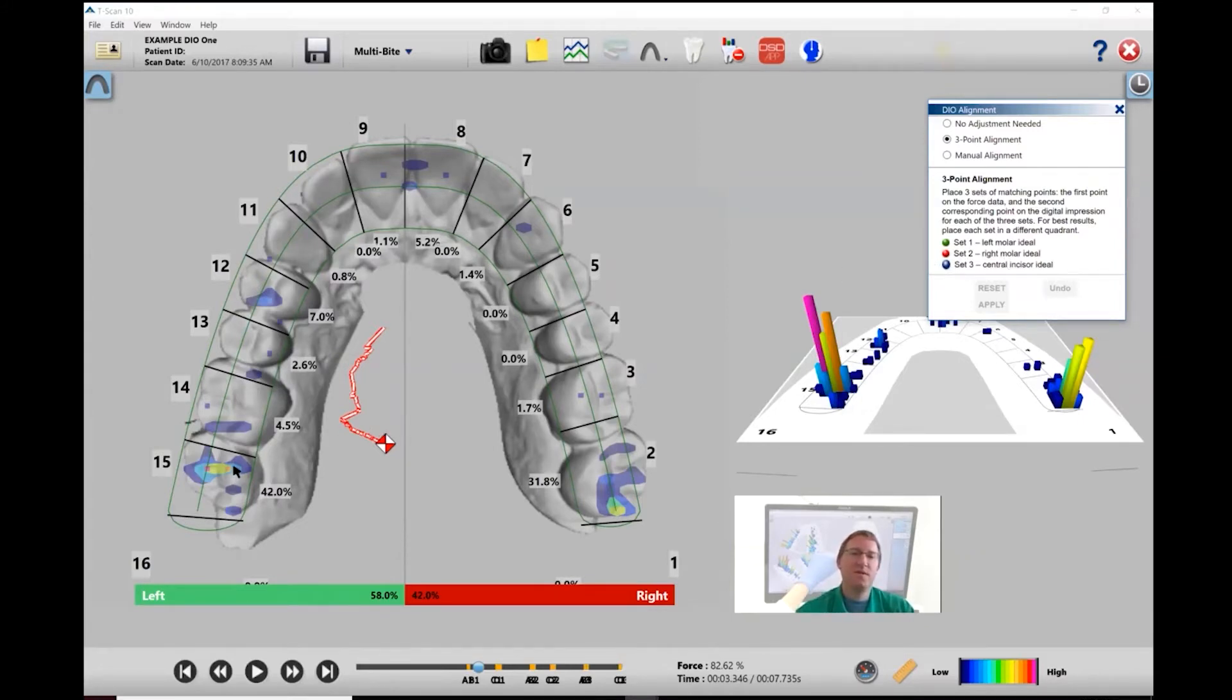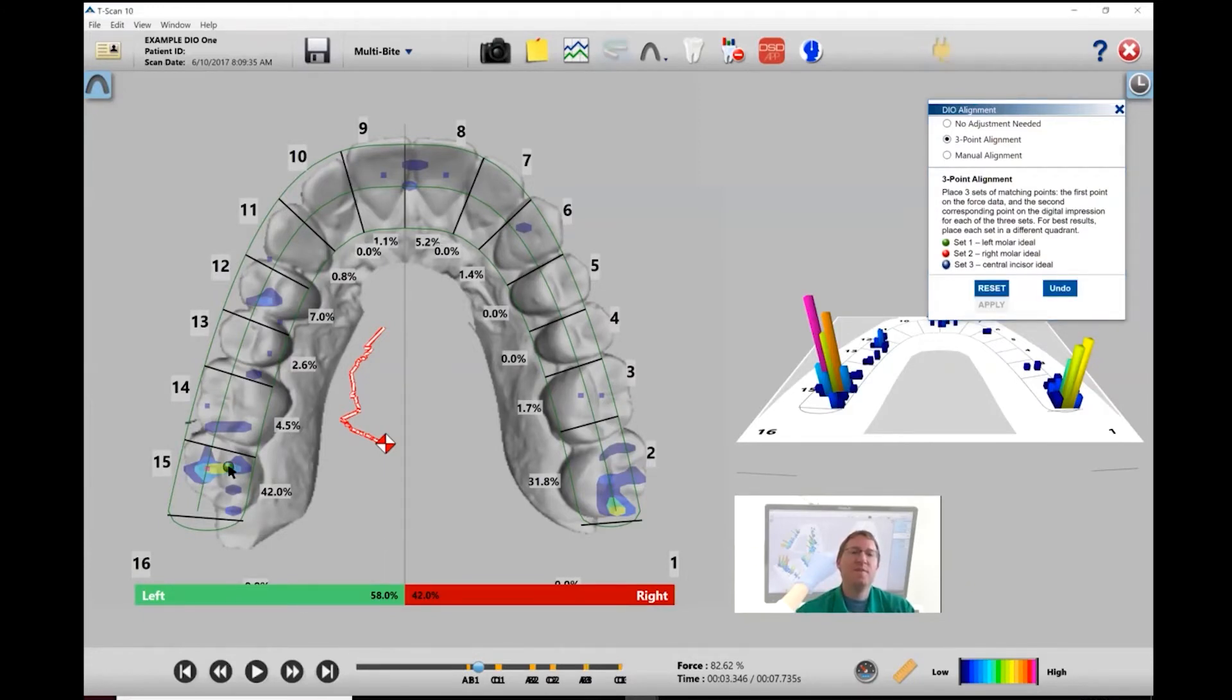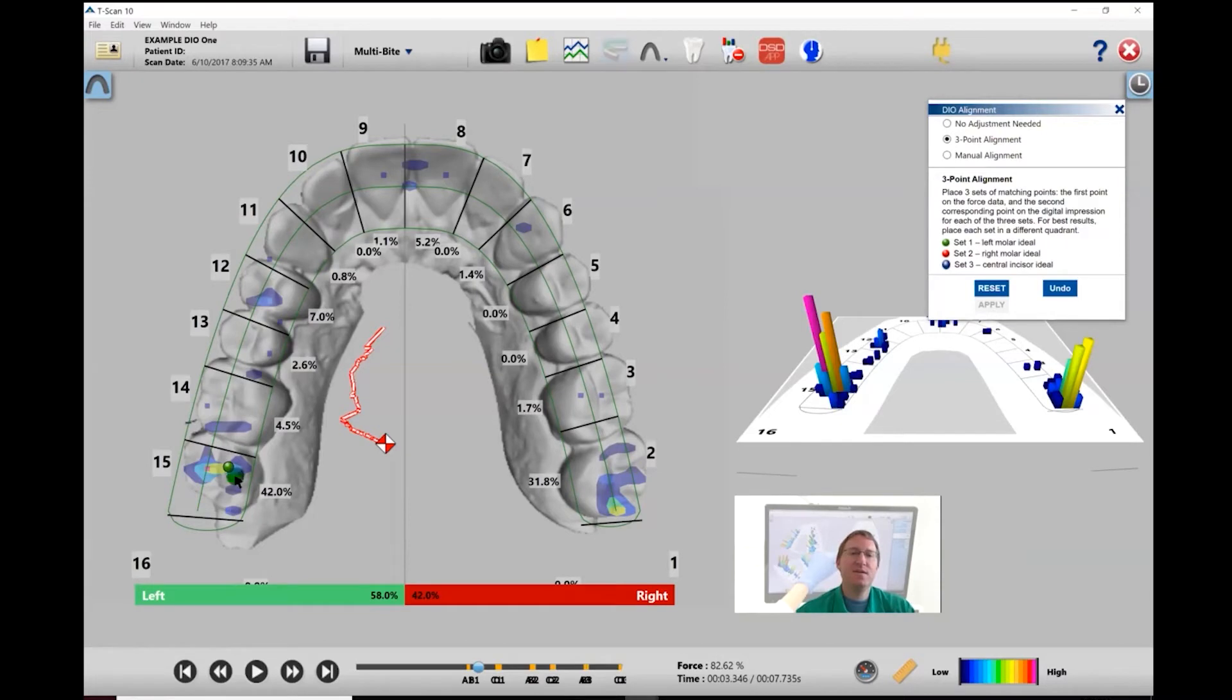First, we're going to pick the forced data or the forced contact point, left-click, and then I'm going to pick the location where I want to move that forced data to. Left-click again, and now we're going to do the same thing for the right molar.